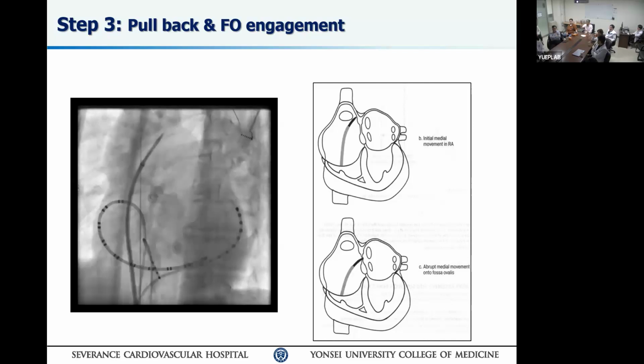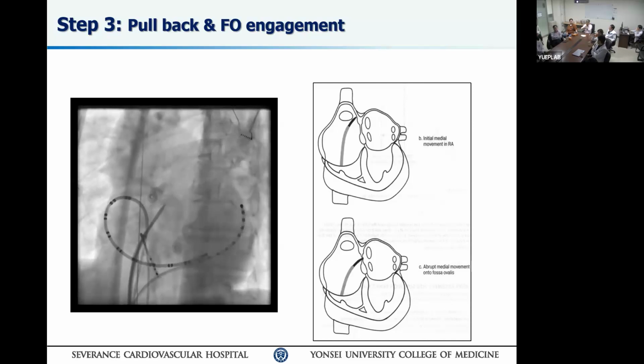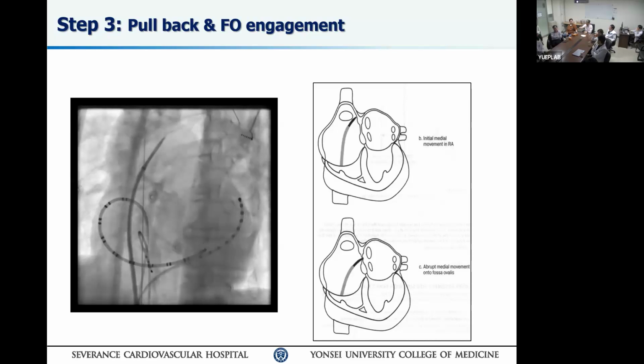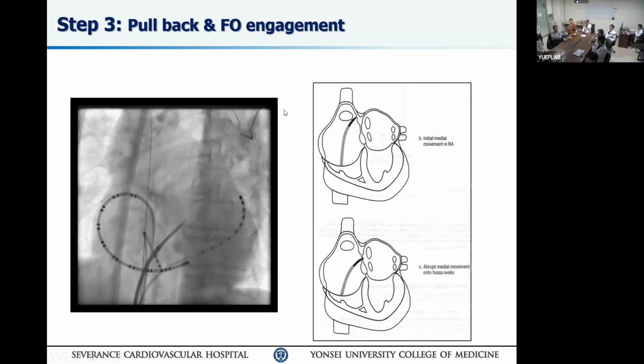So if you rotate it gently clockwise, counterclockwise, you will suddenly see it jump out of that tenting. And then if you go counterclockwise, it's going to go to the aorta, then you feel the aortic pulsation. So you go back to that maximum tenting to the leftward, and follow that line gently. So you're hugging the posterior border of the aorta.